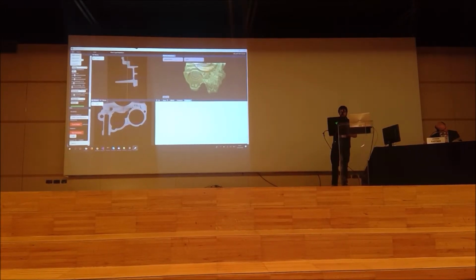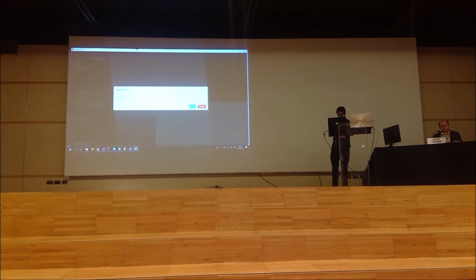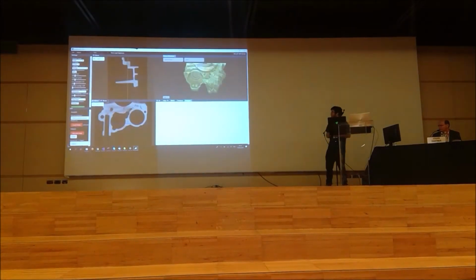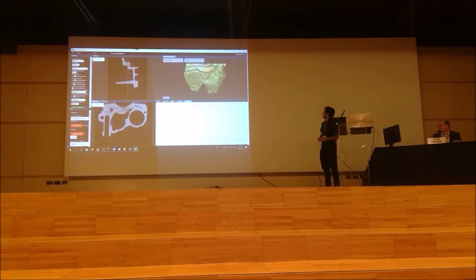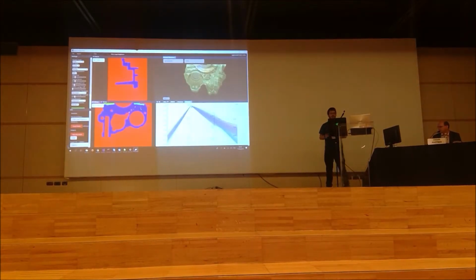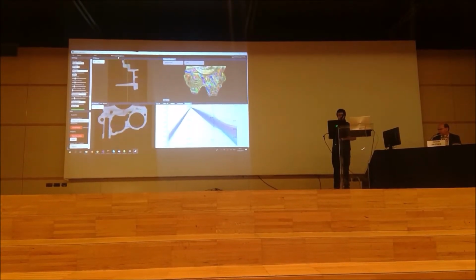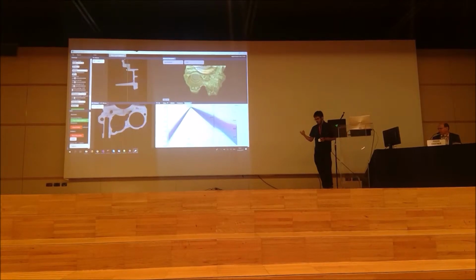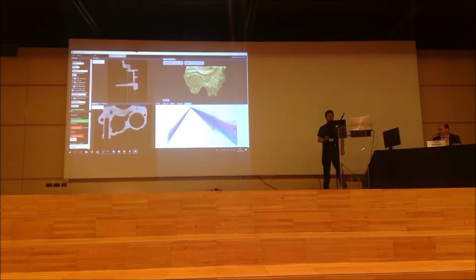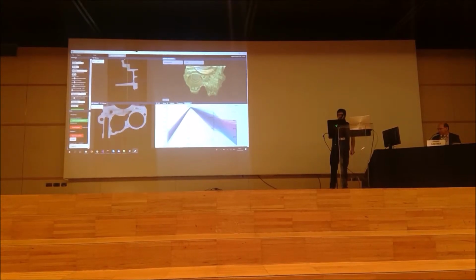What I can do now is I can run the segmentation. This is all running on my laptop here, which I didn't even plug in. However, it uses this rather simple segmentation method, and we arrive with a kind of okay solution. For this dataset, it's rather okay because it's not that nasty, the dataset, right? But if we look at the results, I need to explain.